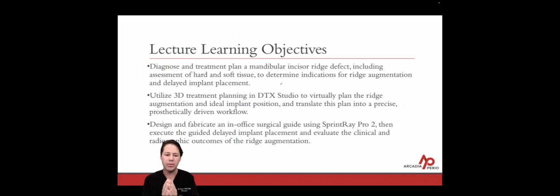Then I want you to be able to design and fabricate an in-office surgical guide. I want you to understand how all of the technologies and how all of the systems communicate with each other. You have the DEXIS ecosystem with DTX Studio, communicating directly to SprintRay technologies. Everything works seamlessly. So if you're new to 3D printing and you want to learn more, again, jump over into our Modern Periodontal Concepts module and you'll understand that workflow in a little bit more detail.